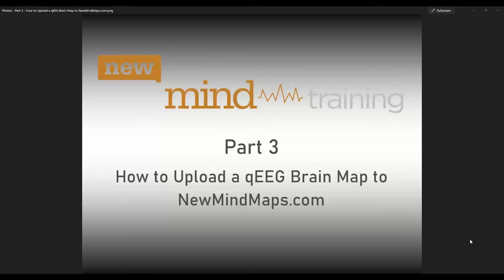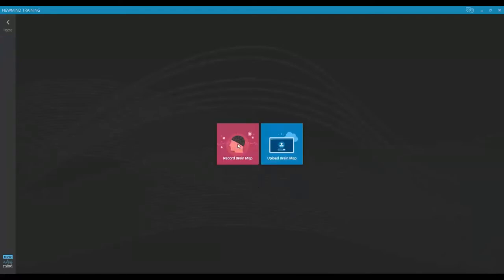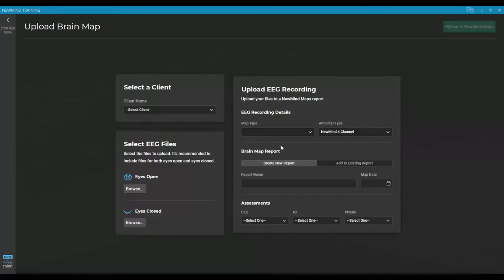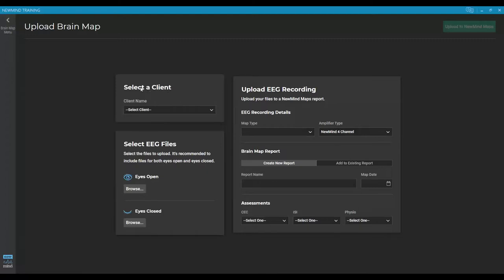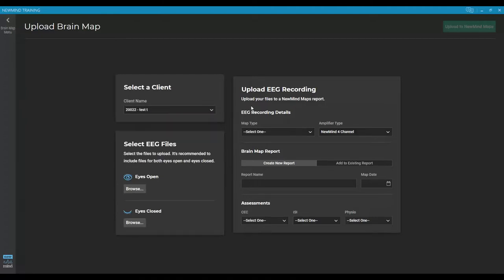So first thing we need to do is to get our software up. And from the home screen, we're going to go to brain mapping. Since we're uploading a brain map, we'll come over and click on the right button that says upload brain map. The first thing the software is going to want to know is who is the client that this map belongs to. So we'll click for our dropdown and we'll pick our test client.